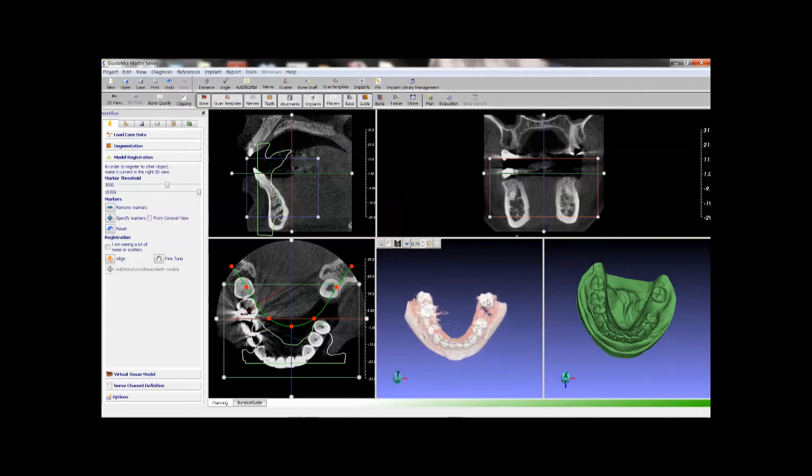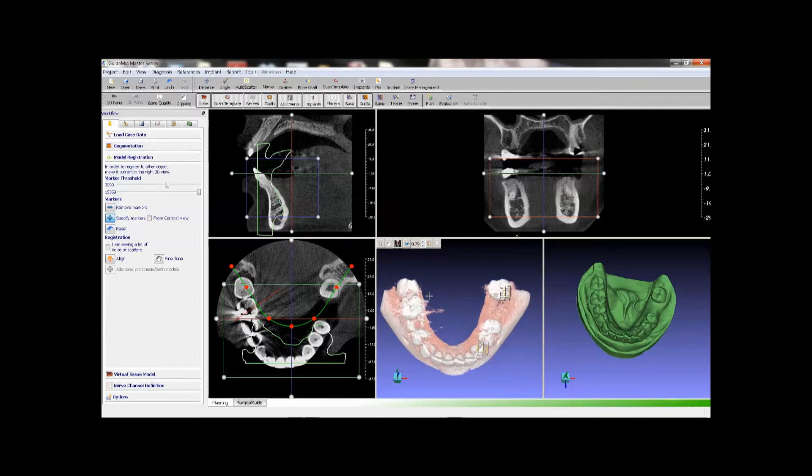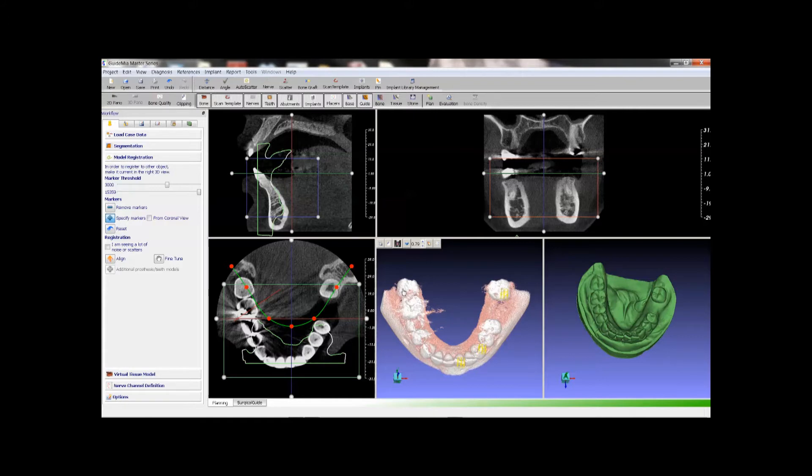Start specify markers. We will place points on both views on some good and clear tooth surfaces. Typically 3 or more points are needed. They don't need to be exactly at the same locations or same order. Please do not make the points evenly, or symmetrically distributed.